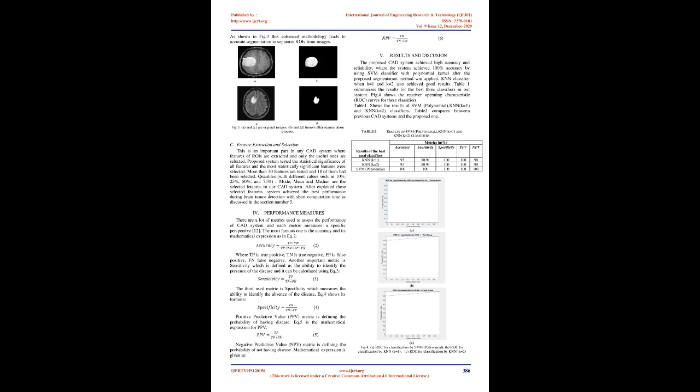3. Methodology. This section summarizes the proposed CAD system in 3 steps: automatic segmentation process to detect and extract ROIs, feature extraction and selection process, and the last stage is the classification process. These stages were carried out using MATLAB R2019b software.